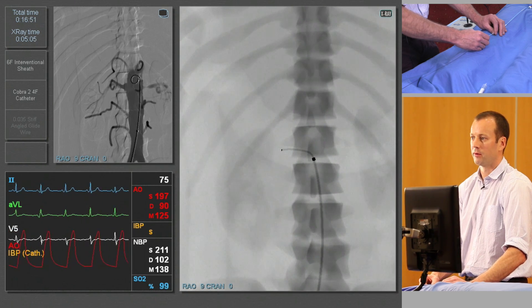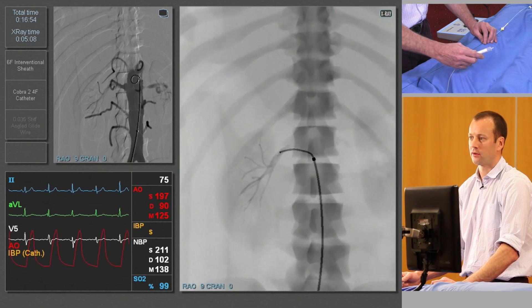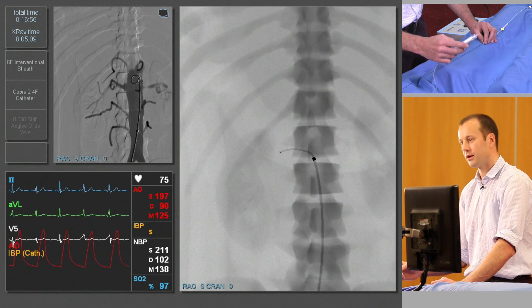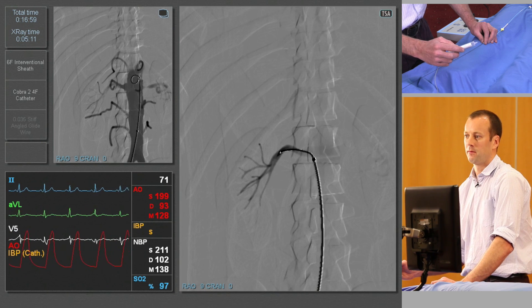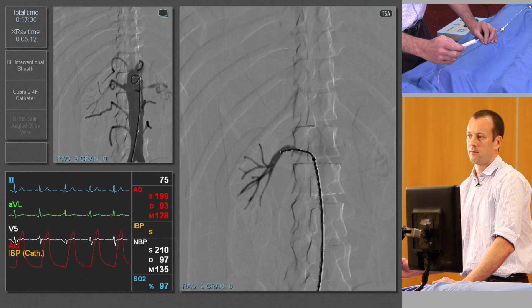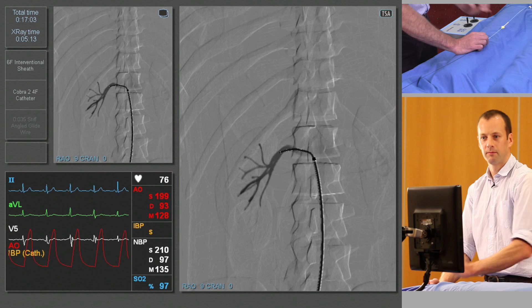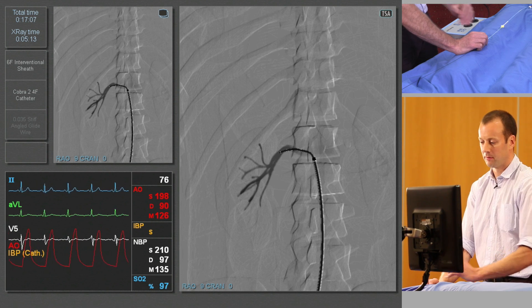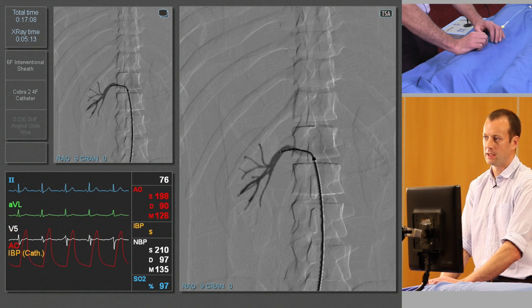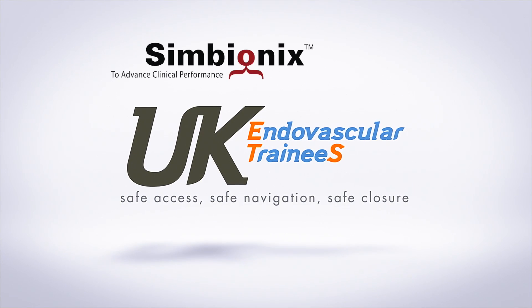Just a little bit of rotation helps withdraw. Another small injection to confirm position. And at this stage we'll do a subtracted run — and a good right renal artery angiogram, seeing upper and lower major pole branches.